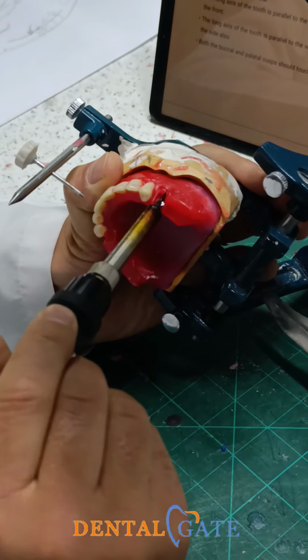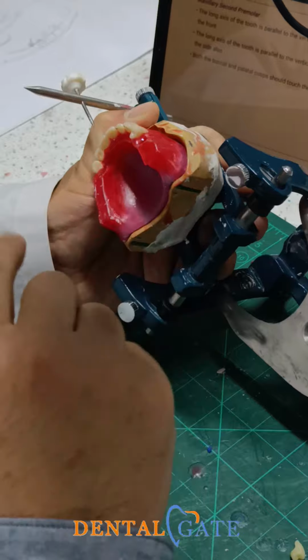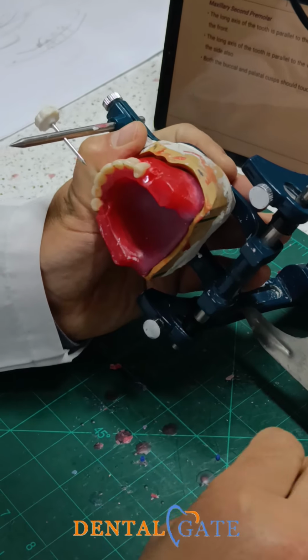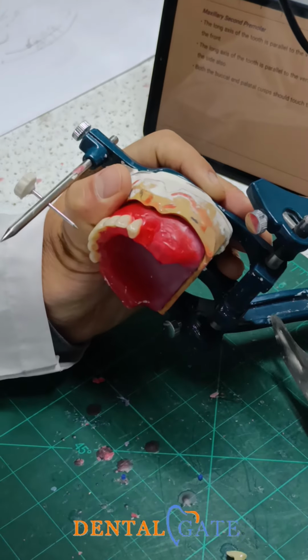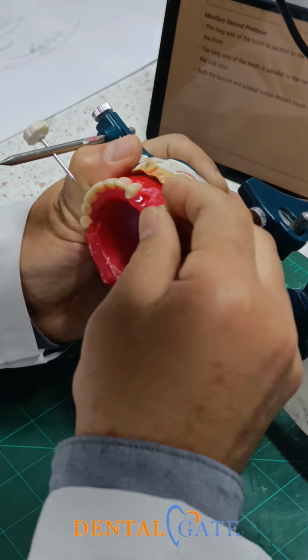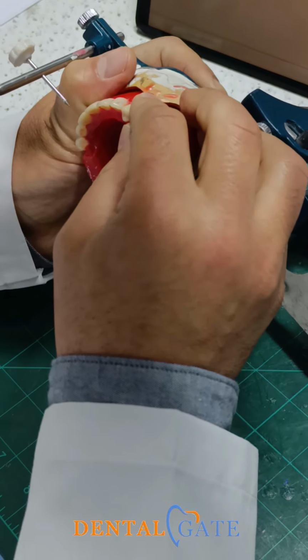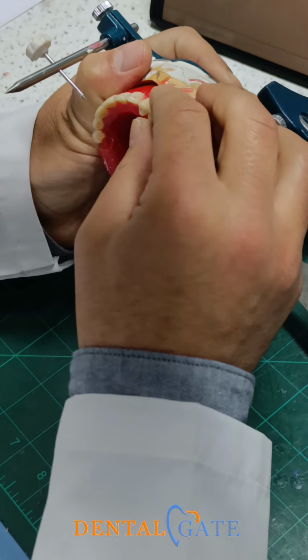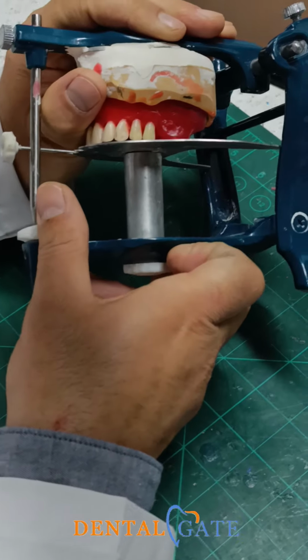Regarding the other criteria for the lines, the teeth should be upon the crest of the ridge. We mentioned that, but in our practice now, we need to make a proper arrangement that serves the occlusal plane.